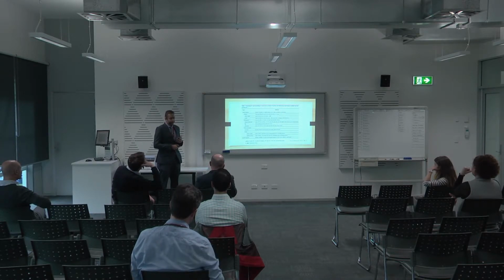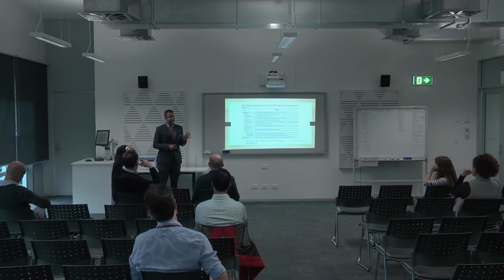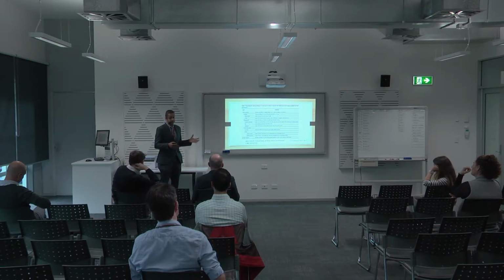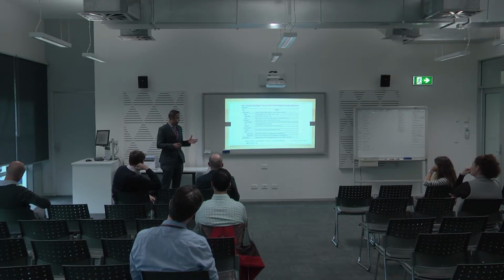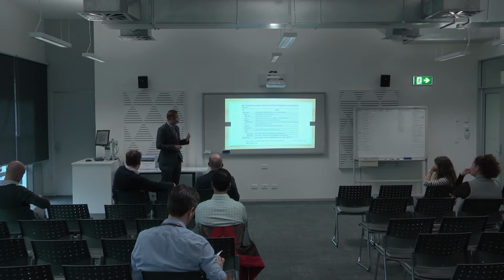Now, when we pick up these dysplastic lesions, this is how we report it. The key question is whether the dysplasia is visible or not, and whether you can resect it endoscopically or not. Because previously, if you picked up dysplasia because it's invisible, it's random, all these patients would end up in colectomy, which has significant morbidity and mortality. So now with chromoendoscopy we can see the lesion, and not only see the lesion, we can actually remove it.